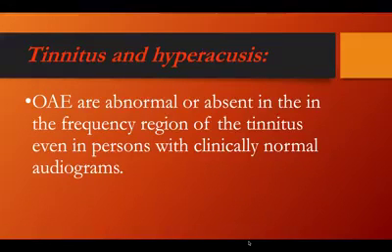Otoacoustic emission is also used in tinnitus and hyperacusis. Otoacoustic emissions are abnormal or absent in the frequency region of the tinnitus, even in persons with clinically normal audiograms.